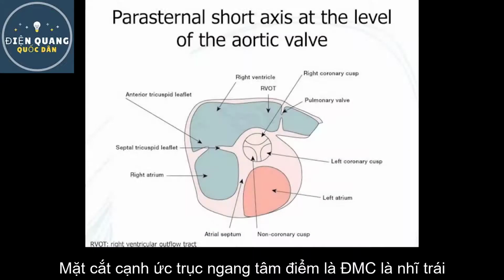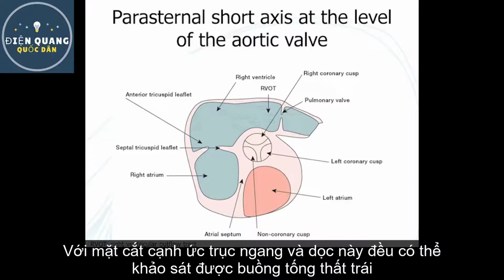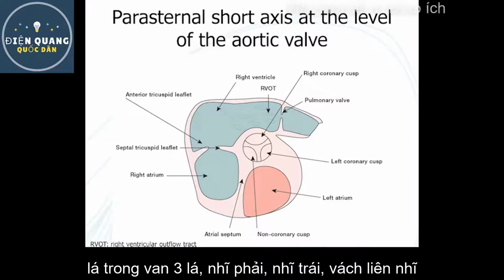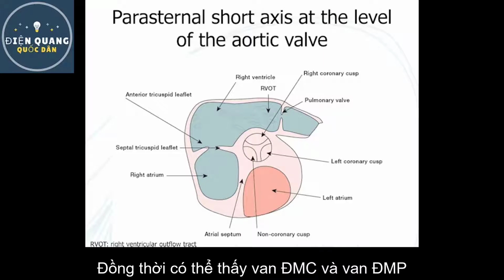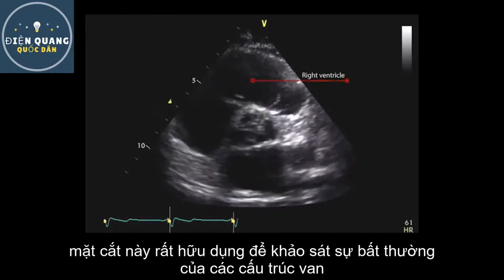The parasternal short-axis view of the aorta and left atrium, shown here, provides similar information to that seen in the parasternal long-axis view of the left ventricle and the parasternal long and short-axis views of the right ventricular outflow tract. Specifically, the anterior right ventricular wall, the anterior and septal tricuspid leaflets, and the right and left atrium and the interatrial septum. In addition, it demonstrates the aortic, tricuspid and pulmonary valves simultaneously. The image shown here is taken from a healthy heart, but this view is extremely useful when assessing structural valvular abnormalities.